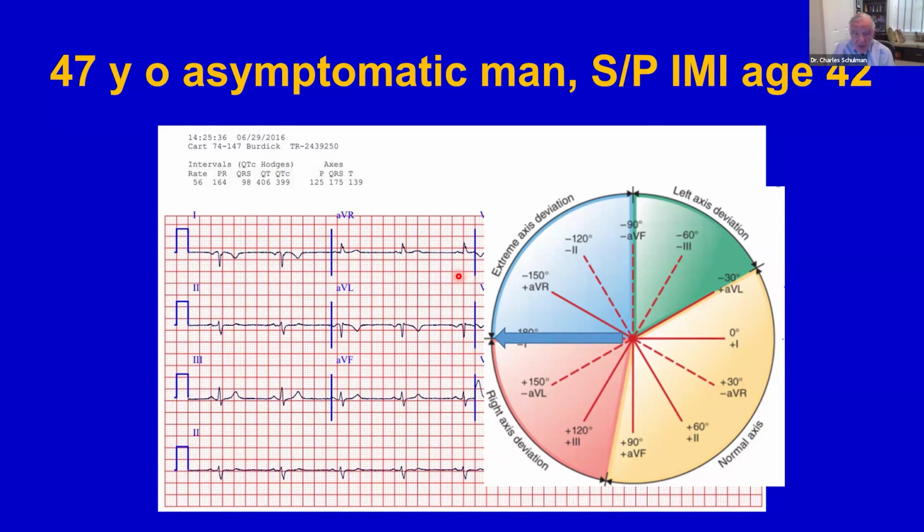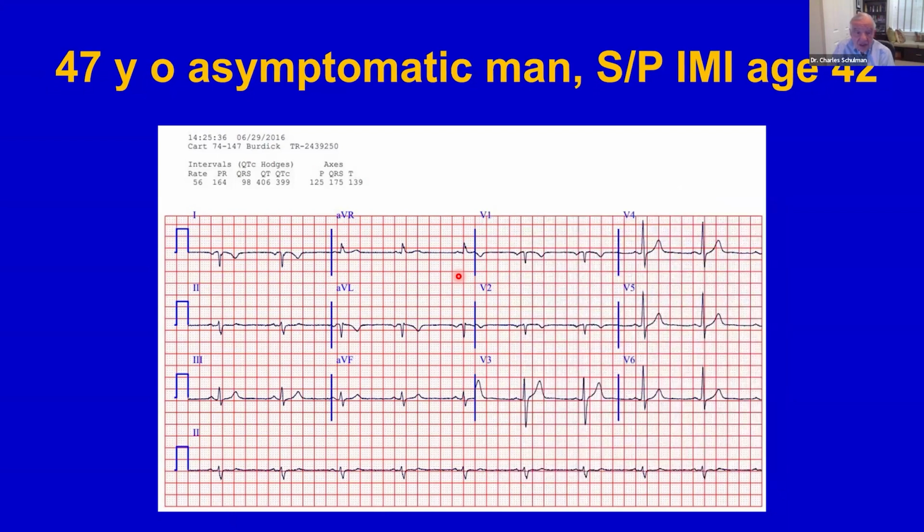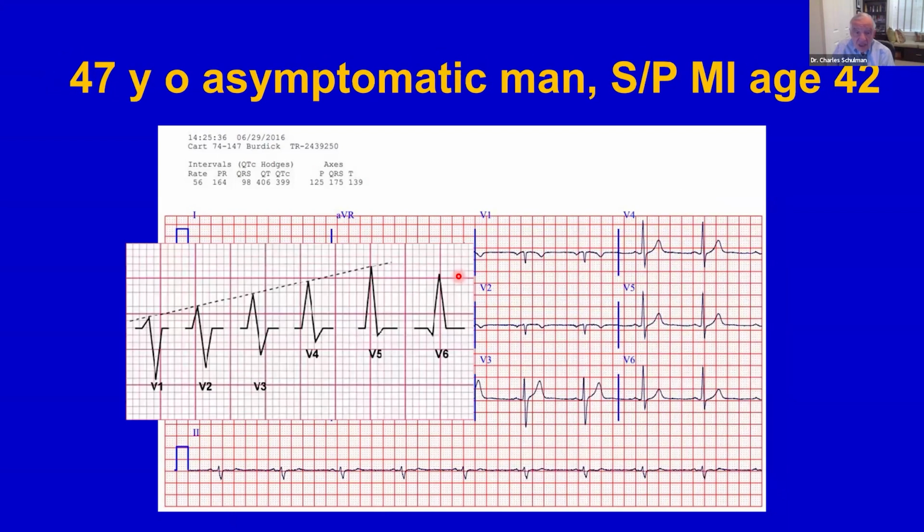But when we looked at this man's baseline, you'll notice that R wave progression is normal. So what do you think's going on?